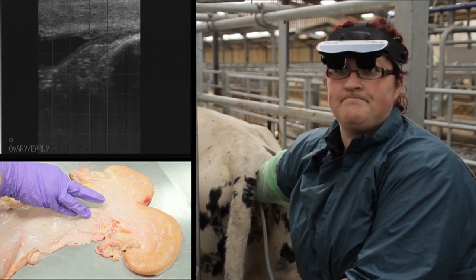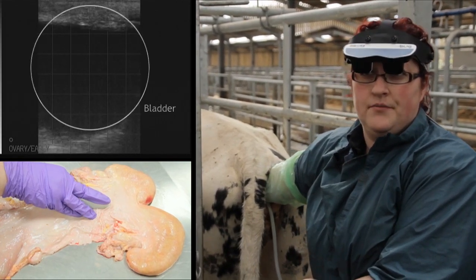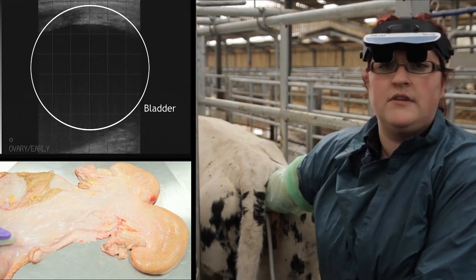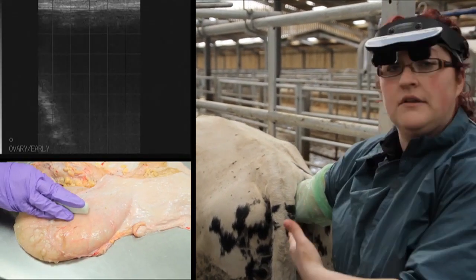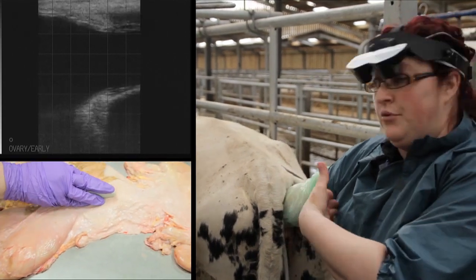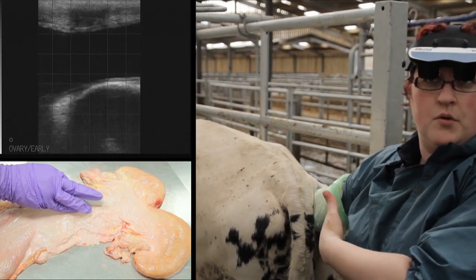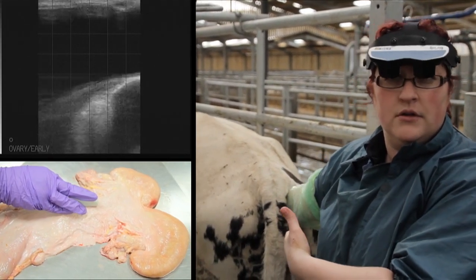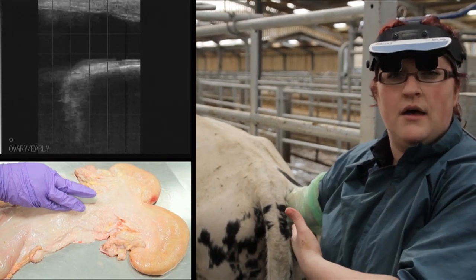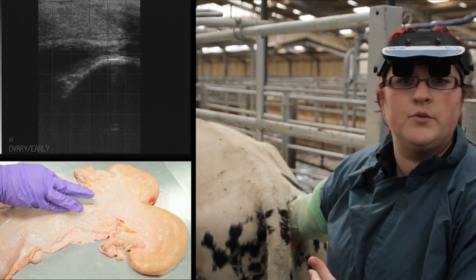And there it is. Don't get confused of the bladder, which you will often see right as you enter into the cow. As you can see, I'm not pushing excessively hard with my arm into the cow at this point. If the cow does have a significant amount of fecal material, we will need to remove that most likely to improve the contact and the quality of the ultrasound image we obtain.